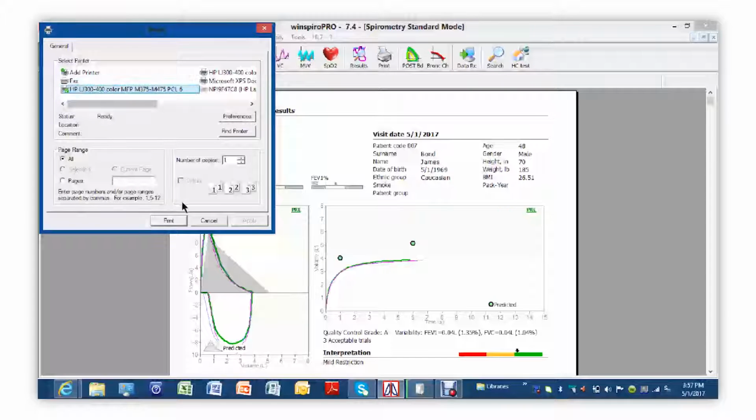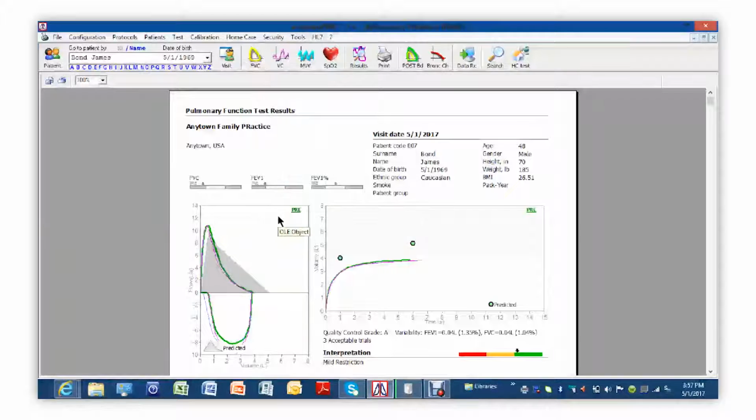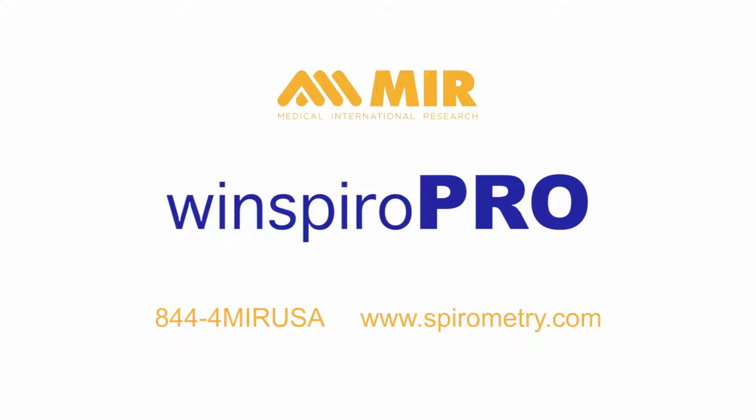You have now completed doing a spirometry test using any MIR device and the WinspiroPRO software. This concludes Part 3, the last of the WinspiroPRO demonstration videos.